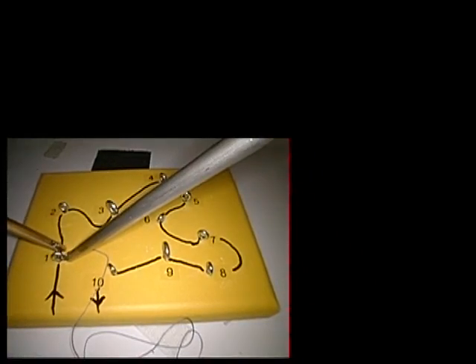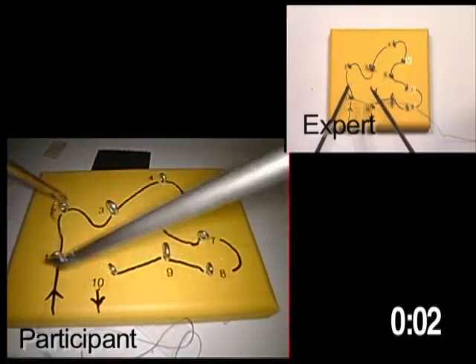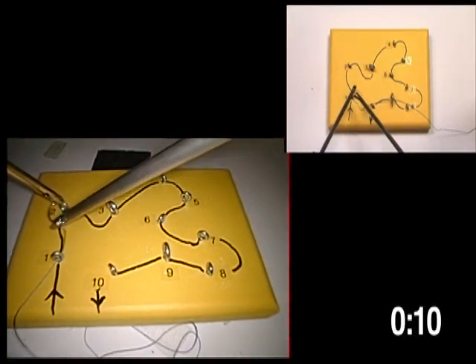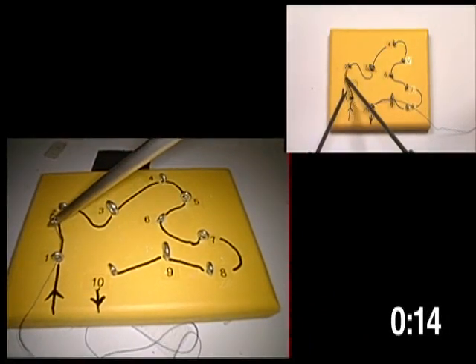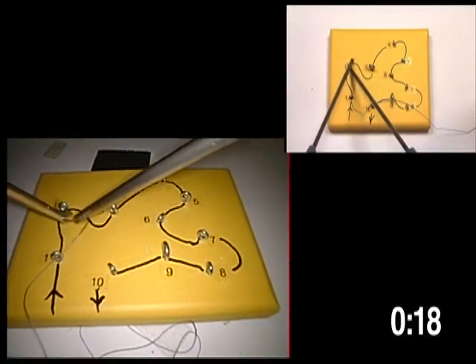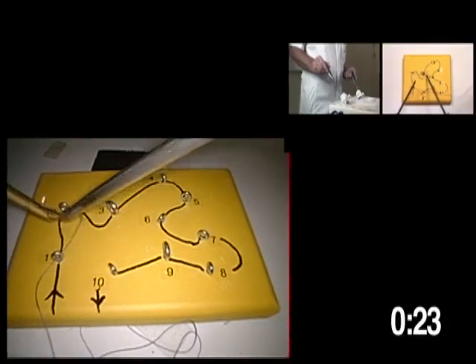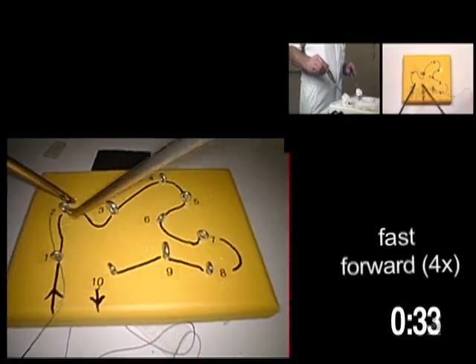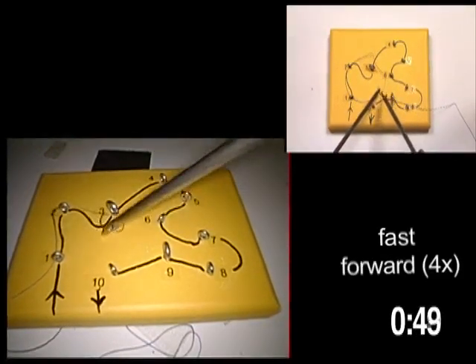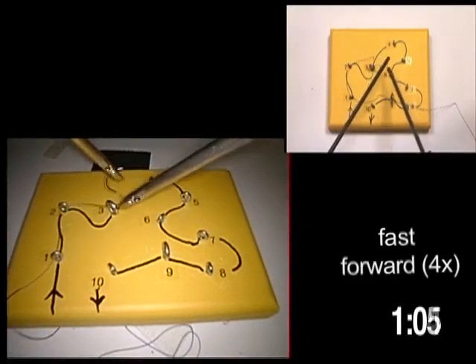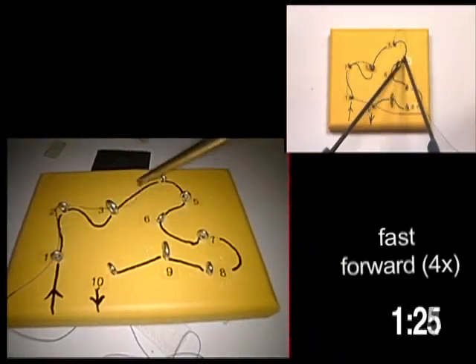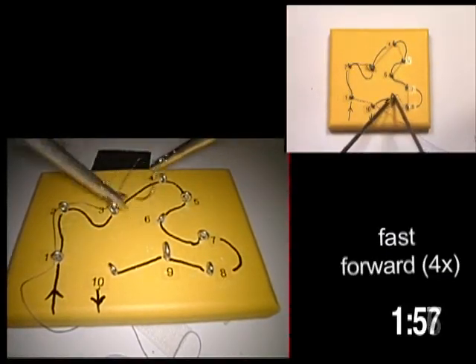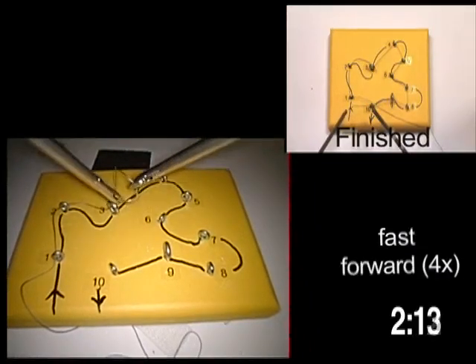Suturing: Use the grand maniere to fix the needle in the needle driver. Use circular movements when pulling the needle through the ring. Time stops when the needle comes out of the last ring.